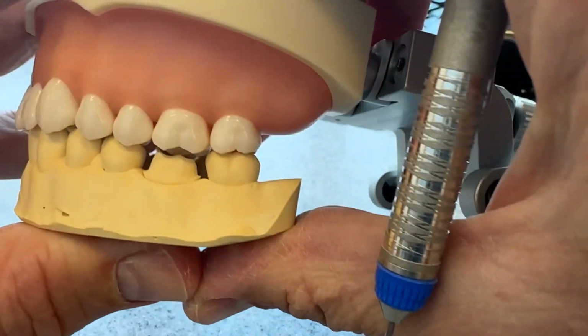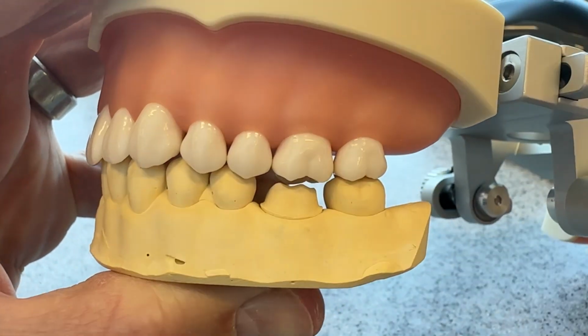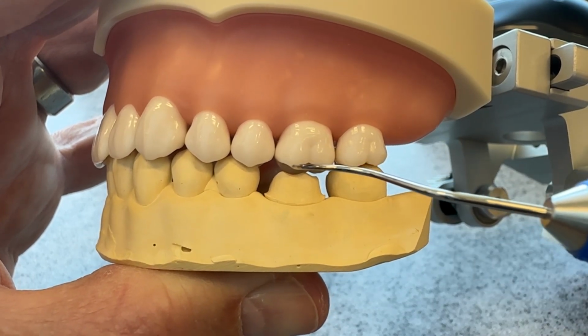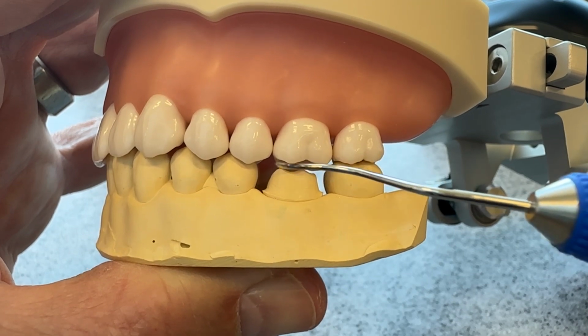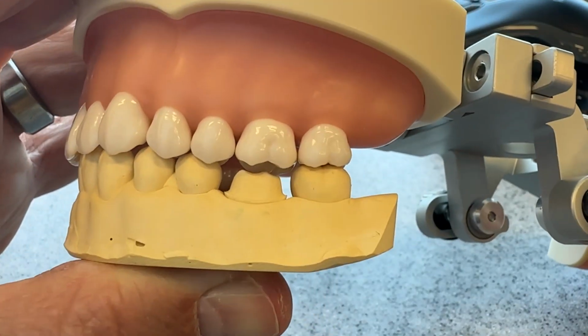Let's peek at the mirroring too. We want to be zigging where the other tooth is zagging. So you can see that our prep, where the upper tooth zigs down, this zigs and zags with it. So that's our mesial distal mirroring. We'll kind of move that around so you can see that from different angles.